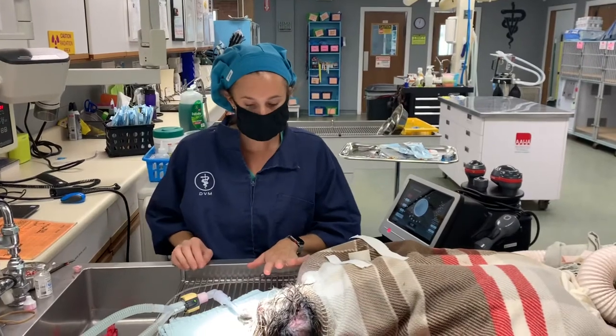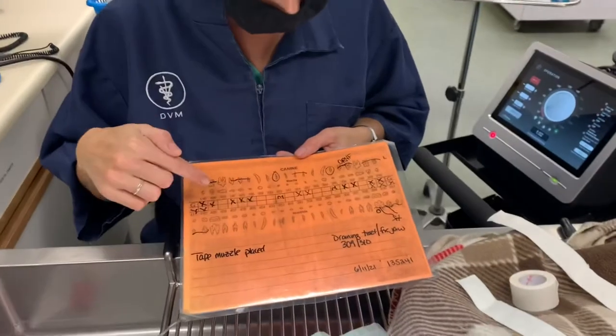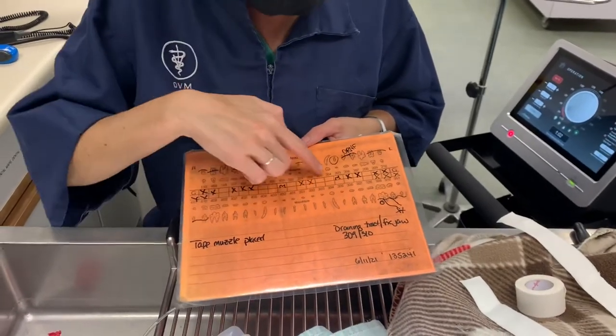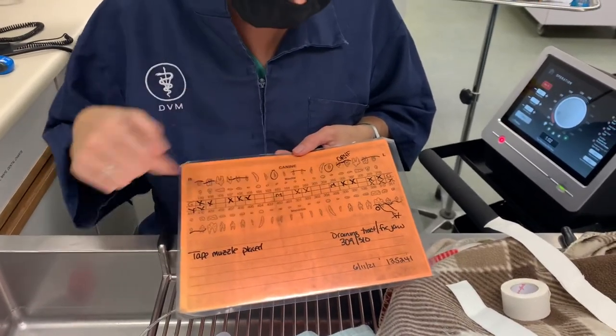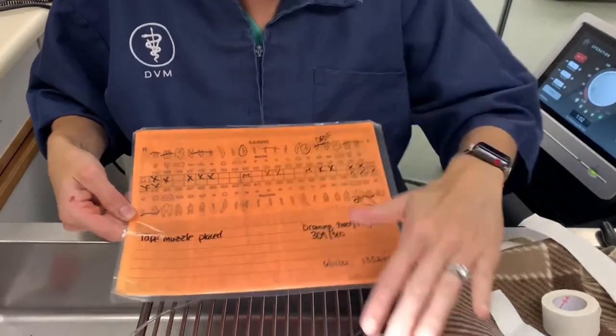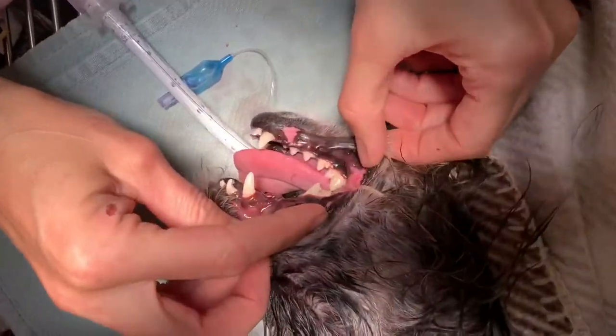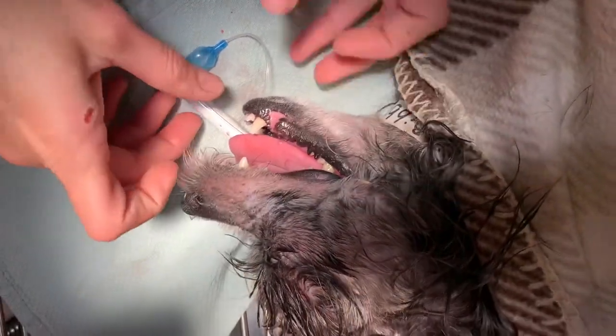We've completed this dog's dental and have extracted a number of teeth. We always make a nice dental map along with our x-rays. We can see here all of the teeth we extracted along the upper arcades — there were some missing already. Here's where we have our fracture. Now that everything is clean and we've removed all the diseased teeth, we're going to place a tape muzzle.